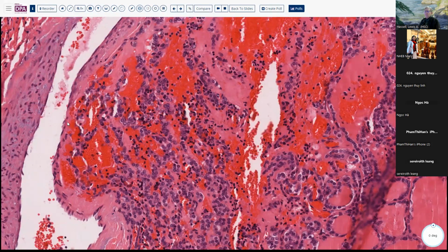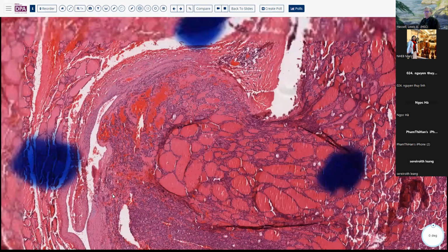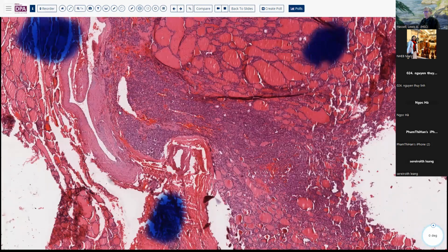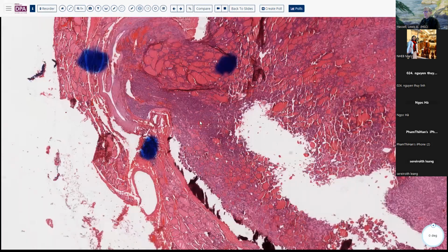Now, sometimes this is how we get close to vascular invasion, when we get tumor that's growing like this. Just a little further and it would be truly subendothelial. You might be inclined to call that vascular invasion if you just have a minimal amount of endothelium overlying the tumor. But certainly we don't need that in follicular carcinoma to make the diagnosis.